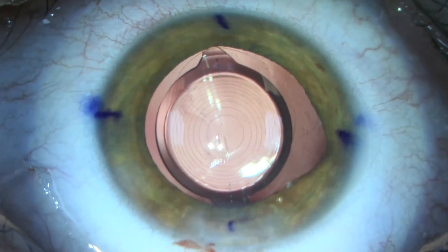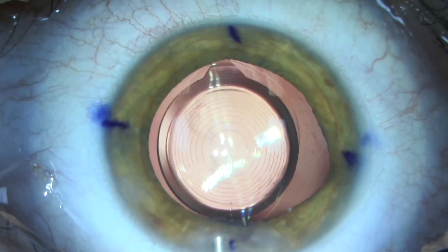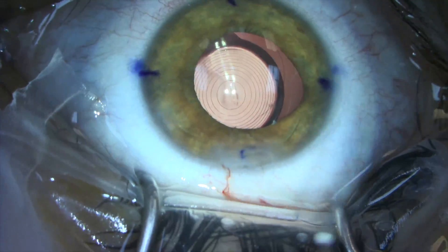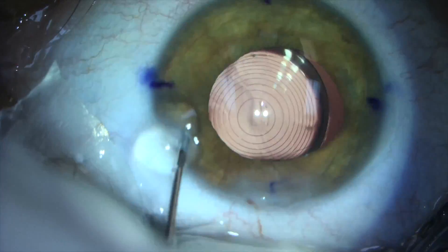Her pupil has been pharmacologically dilated to allow us to remove the cataract and insert a symphony lens implant. Once the implant is aligned and centered, we instill myostat to bring her pupil back to its normal conformation. A 9-0 prolene suture, shown here, will be used to repair the pupil and iris defect.